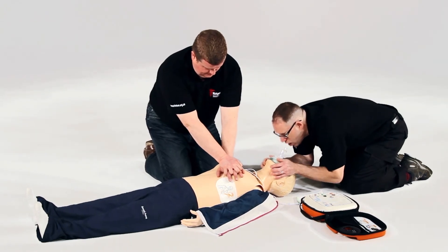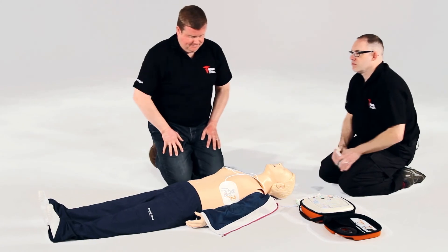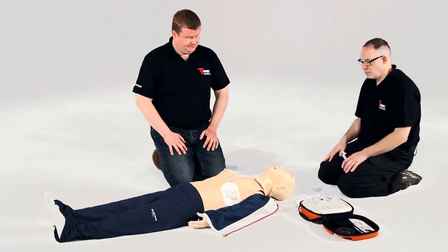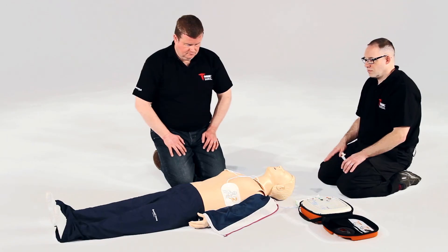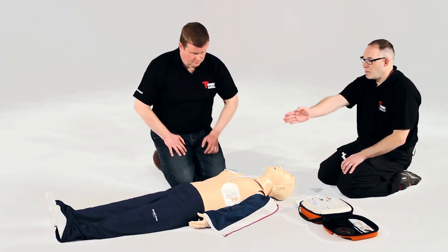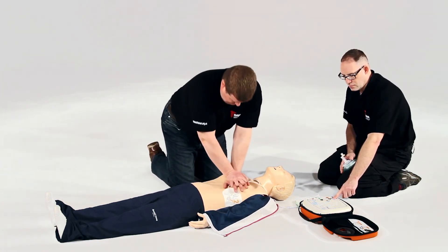Do not touch the patient. Analyzing heart rhythm. Stand clear. Do not touch the patient. No shock advised. Begin CPR now. Carry on. Press the flashing blue I button for CPR voice prompt.